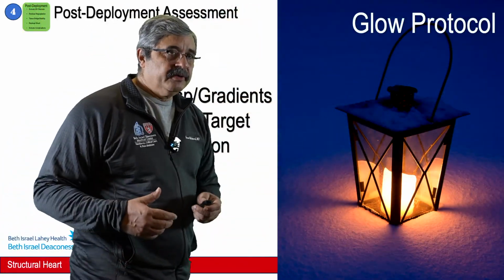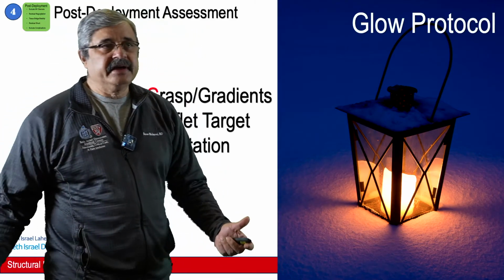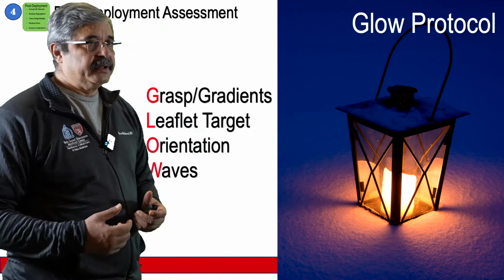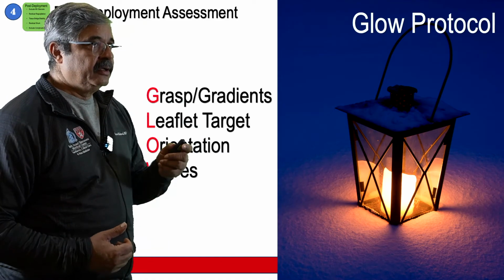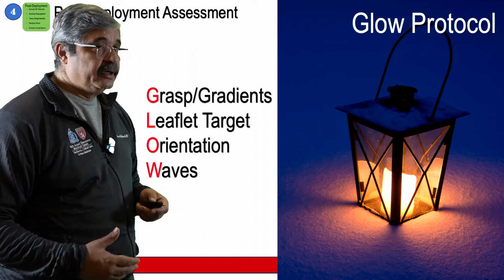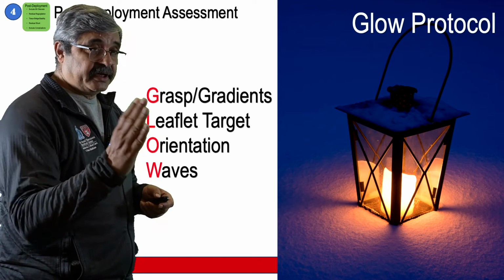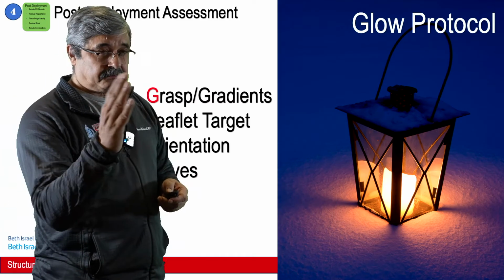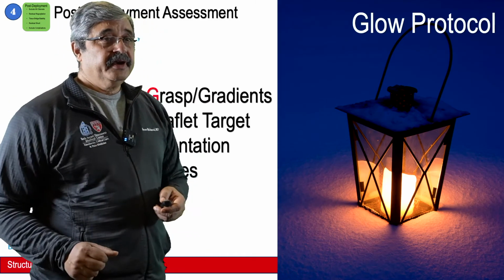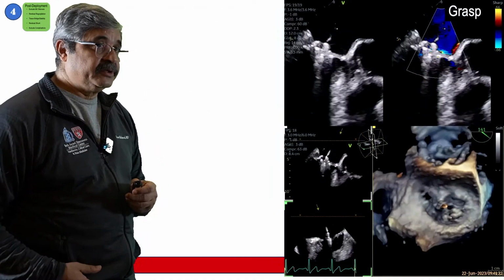The protocol that we use after deployment of the clip is called the GLOW protocol. We use these kind of strange names just to make the fellows remember them. And the GLOW protocol is based on GLOW. G stands for grasping of the leaflets and the gradients, L for the leaflet target, whether we achieve it or not, O for orientation of the clip so that it is perfectly orthogonal, it is not oblique, so that we are not torquing the valve, and finally W for the waves, and we'll discuss which waves.